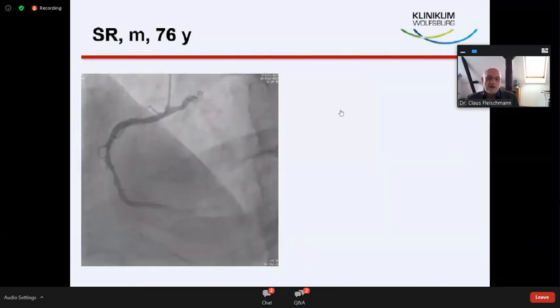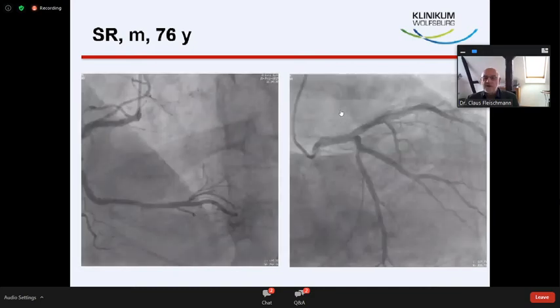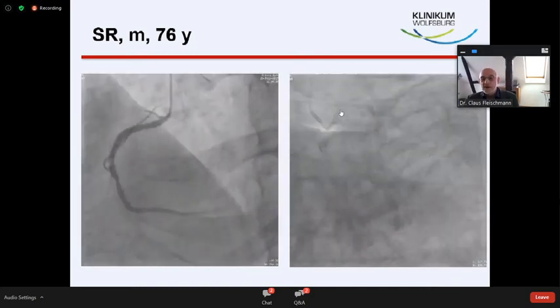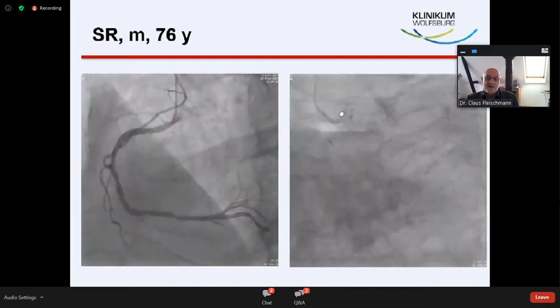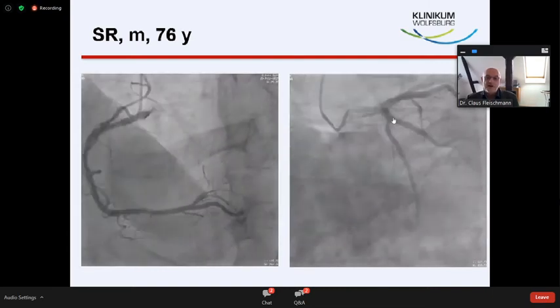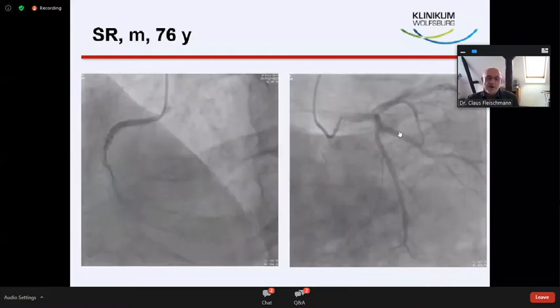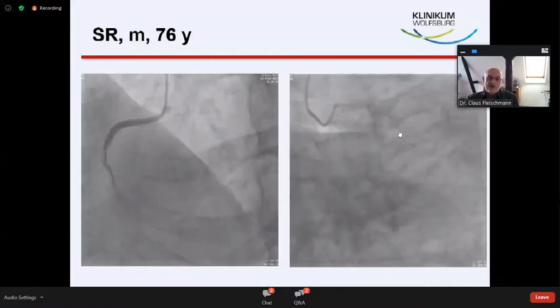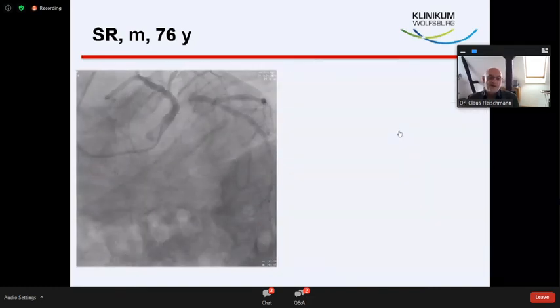So we do the left coronary artery, and now we can go home. We have no stenosis. Do you agree? Yeah, little surprise, we have to do more projections. It's always crucial to get projections to have every bifurcation and every part of the artery really free sight on. And the next projection shows the problem.